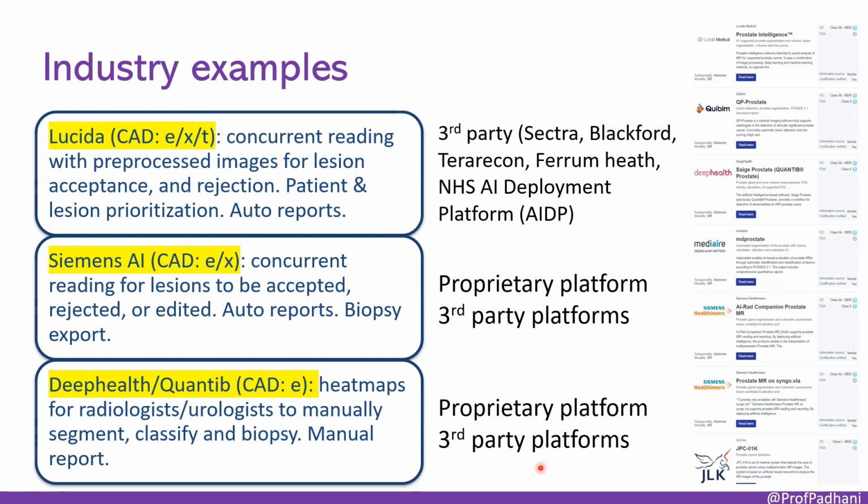Deployment also varies. Some AI tools integrate into third-party platforms, meaning they can run within your existing PACS or vendor-neutral archives like Sectra, Blackford, or national platforms like the NHS AI Deployment Platform.